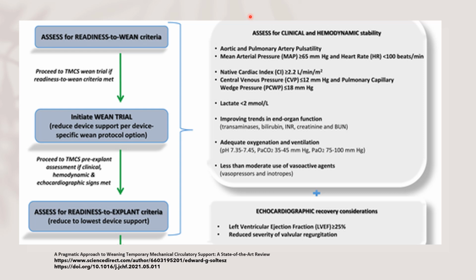If there is an ejection fraction of more than 25, sometimes we remove the balloon, especially if the patient has improved and can tolerate it after chronic ischemia, and a reduction of the severity of the valvular lesion is okay, and we can remove the balloon.